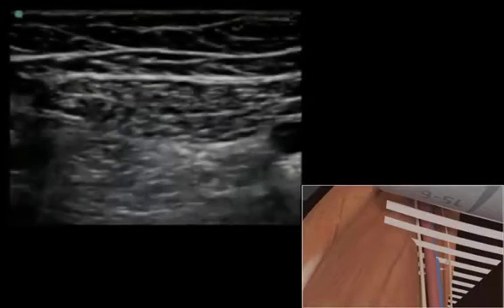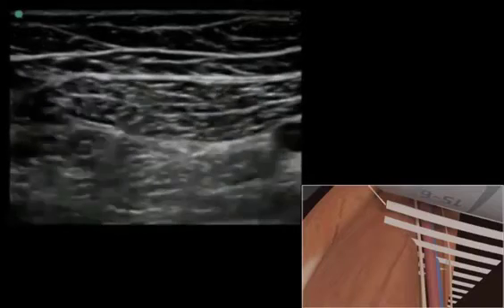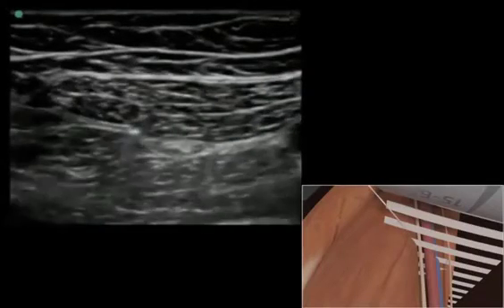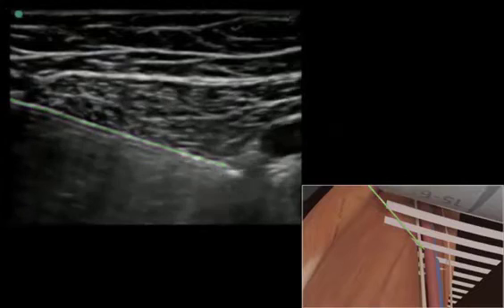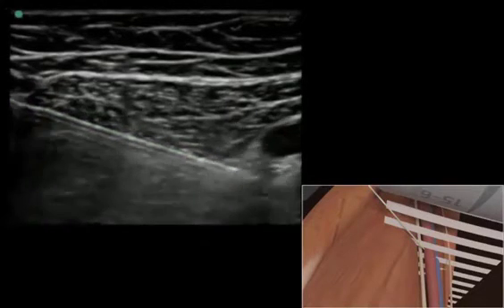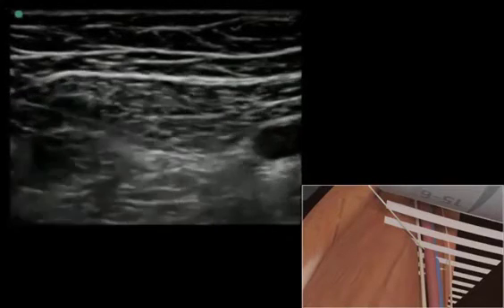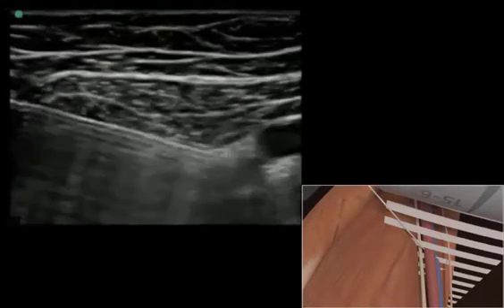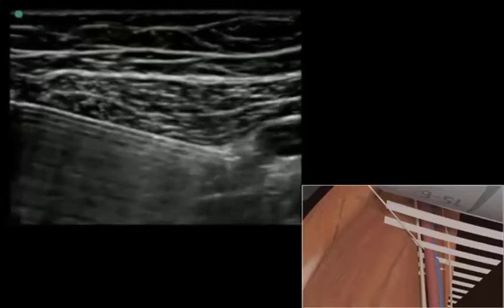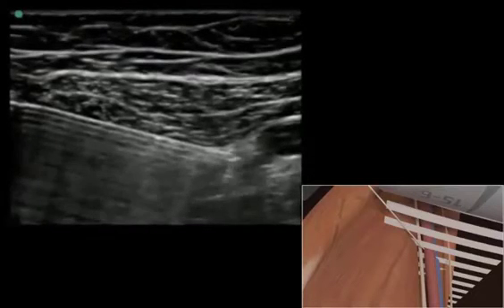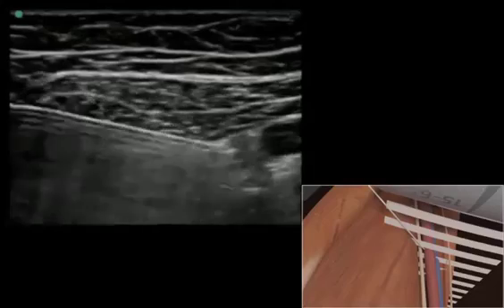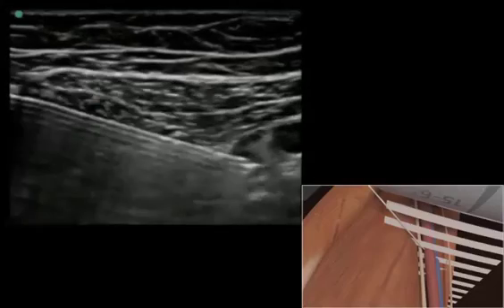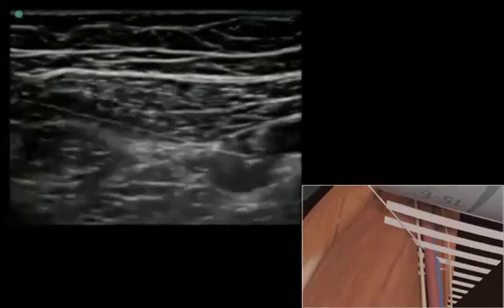The needle should be inserted in plane in a lateral to medial direction. Once the needle tip is visualized next to the nerve, or if unable to visualize the nerve lateral to the artery, local anesthetic is injected. A hypoechoic pool of local anesthetic will be seen spreading above and around the femoral artery.